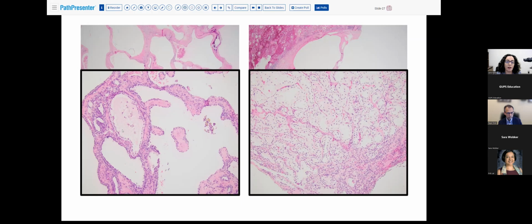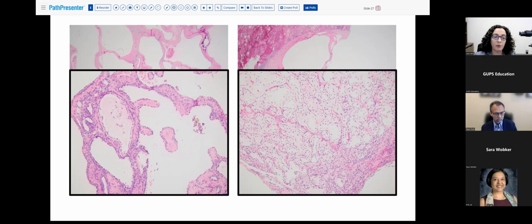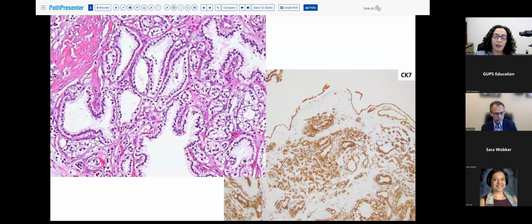where the nuclei are more towards the lumen, and picket fencing next to each other, leaving the cytoplasm, which is clear under them, looking like piano keys. And this morphology is seen also in the tubular portion of this tumor, as well as potentially in these nests of clear cells. They can have papillary growth, they can have cystic growth, solid nested clear growths.